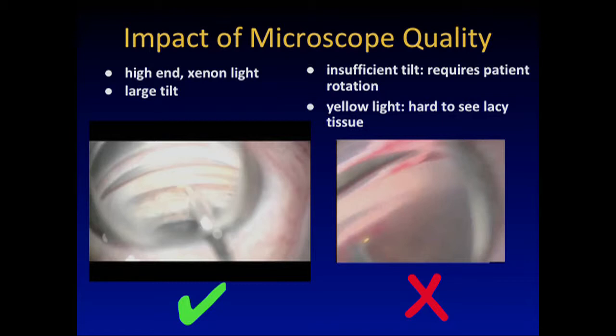This is both me operating — the right is one of my first cases at UPMC that I did for our chair as co-surgeon, because he knew I had great outcomes with trabectome. That ended up not going well. What you'll see on the right side is that I likely go after the ciliary body — there is blood. You should not see blood during the ablation. The eye is pressurized, above 40 or so due to infusion pressure — there is no reason to see reflux from venous tissue from Schlemm's canal.